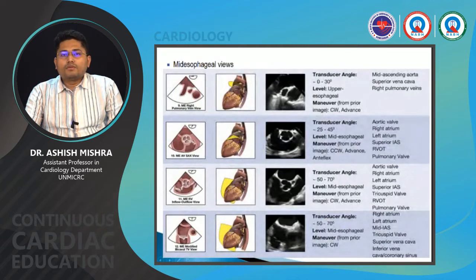see the aortic valve, we can see the NCC, the LCC and the RCC. This is important to assess the aortic valve, both native as well as prosthetic valves. We can also see the RVOT, and the pulmonary valve over here. So this is basically the RV inflow aortic valve short axis view, where we can study the aortic valve.